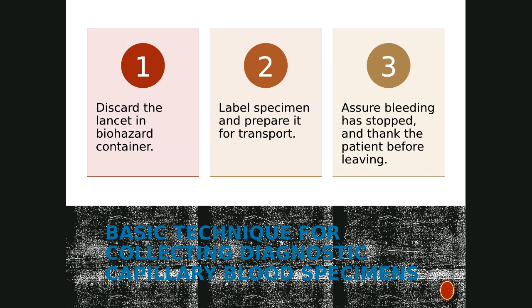You're going to discard the lancet in the biohazard container as soon as possible. Label the specimen, prepare it for transport, and assure bleeding is stopped and thank the patient before leaving. Again, please reference in your textbook page 376, which goes over in detail the preparation for skin puncture and supplies needed, as well as competency checklist 8 in your textbook.